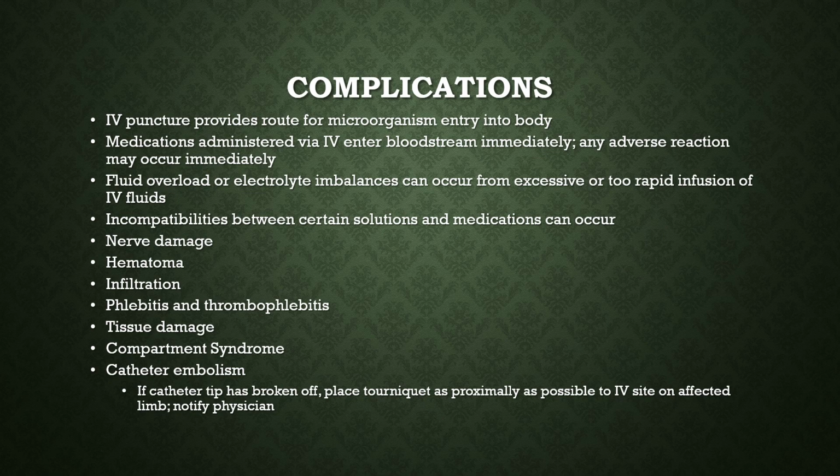If you don't know where the catheter is, there's no point in putting a tourniquet. You just call the doctor immediately. What we're trying to do is prevent that catheter from floating into the systemic circulation.